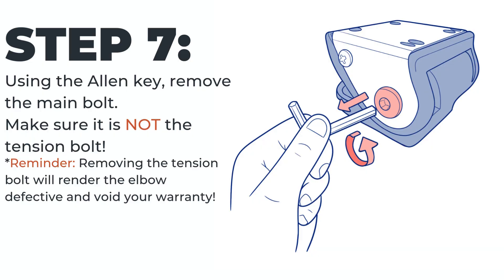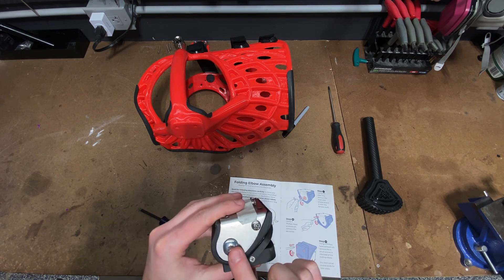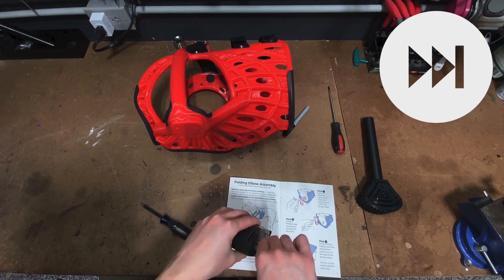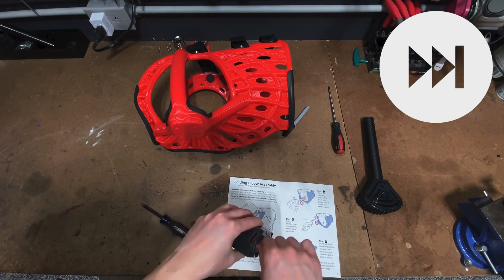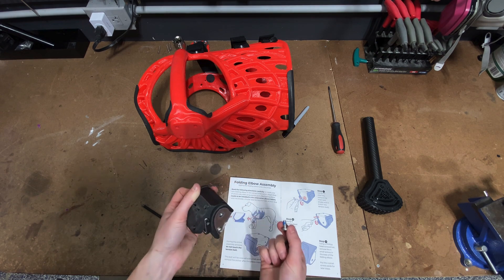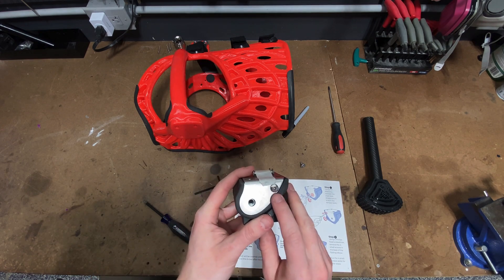Step seven: using the allen key, remove the main bolt. Make sure it is not the tension bolt. As a reminder, removing the tension bolt will render the product defective and void your warranty. Step eight: using a Phillips head screwdriver, remove the set screw. This screw should be on the same side as the main bolt.